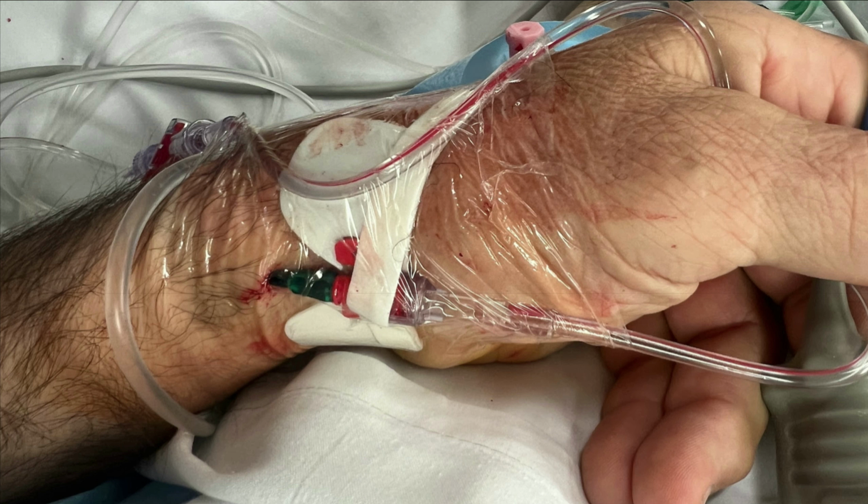And if you go into the ICU, to the operating rooms, or into high dependency units where very sick patients are located or patients are having major surgery, you'll see patients with a line like this placed in their radial artery, for example. And we love these lines because when they're used correctly, they provide beat-to-beat measurements of blood pressure, allowing meticulous monitoring and careful titration of vasoactive drugs.